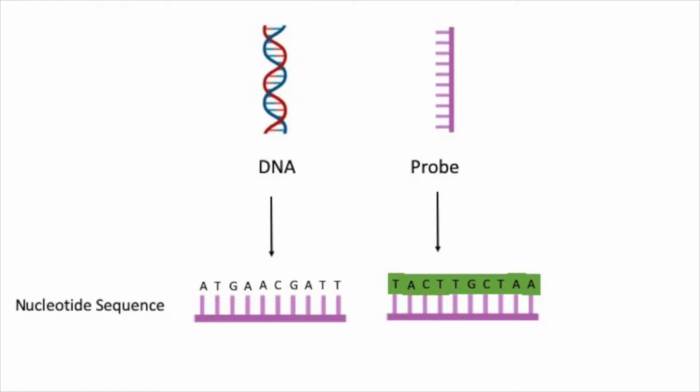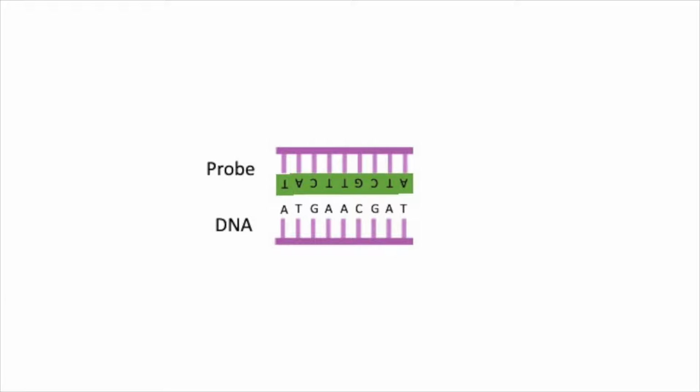Step 1 of an in situ hybridization is making probes that will only bind to GABA receptors. The probe is a sequence of nucleotides, like the ones you would find in DNA or RNA. That would be A, T, C, and G for DNA, and A, U, C, and G for RNA. These sequences of nucleotides are a perfect complementary match to the sequence of nucleotides on the gene that I'm interested in looking at. Because it's 2019, I can go online and order the exact sequence I need for my probes.